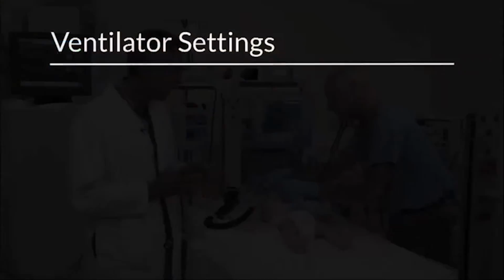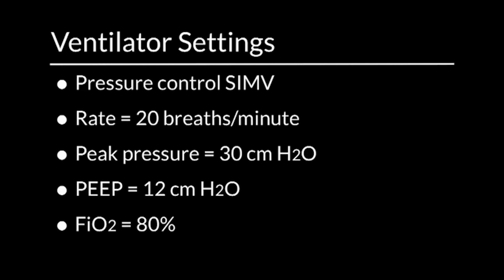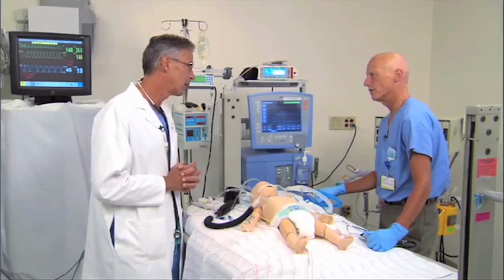And Barry, what settings are we on right now? John, we're on pressure control SIMV. She's on a rate of 20. Our peak pressure is 30 and our PEEP is 12, and she's still on 80% for an oxygen concentration. And these settings have been increasing overnight? Yeah, they have been steadily.